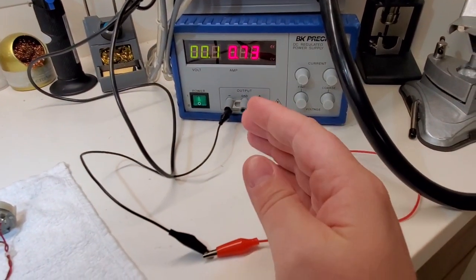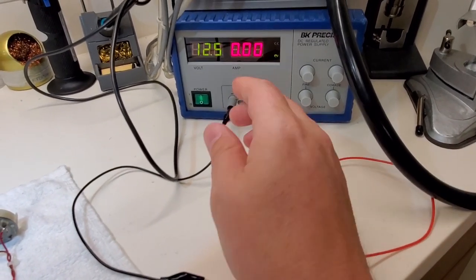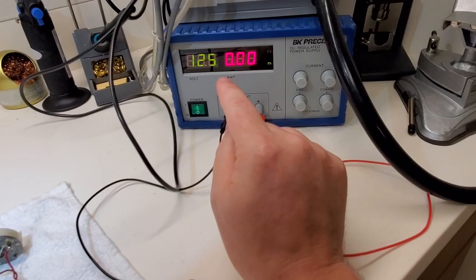So what I did is I connected my power supply. I set it to less than an amp. And then when you disconnect your leads, now you set your voltage.